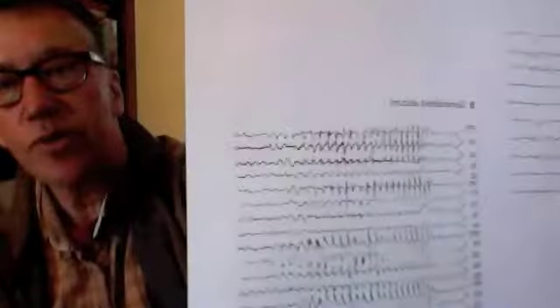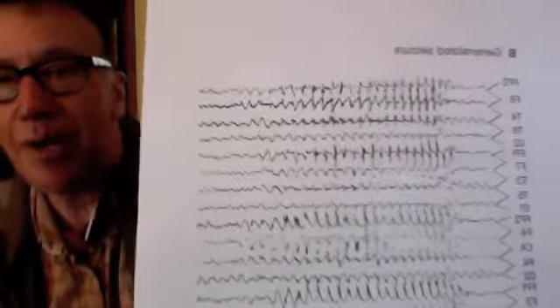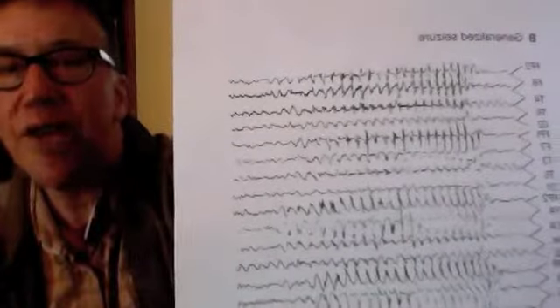So it gives you a little sense, when Wilder Penfield is going to go in and perform surgery on somebody, they might have some information about where the inappropriate electrical activity is actually occurring before they start. On this other side, you can see a really quite clear demonstration of a lot of spike and slow wave activity occurring on multiple electrodes. So this is a much more generalized seizure that's going to be much more visible in terms of its functional consequences.